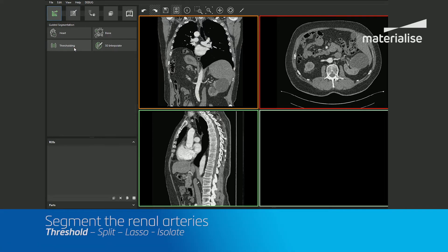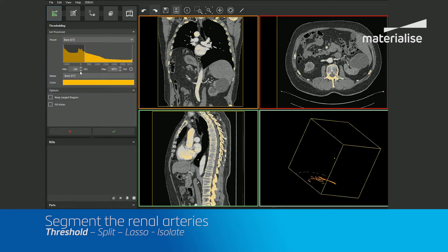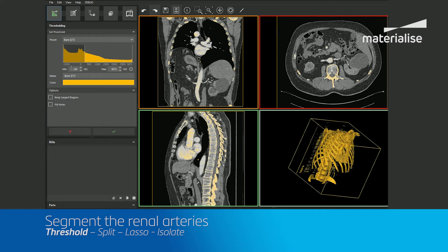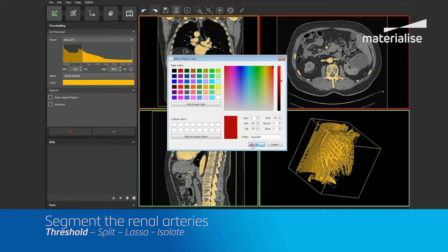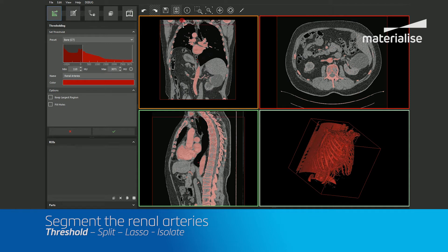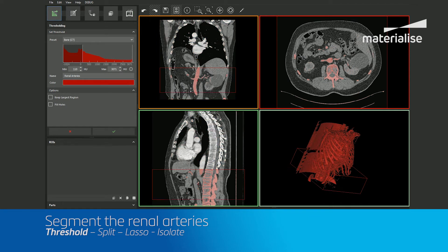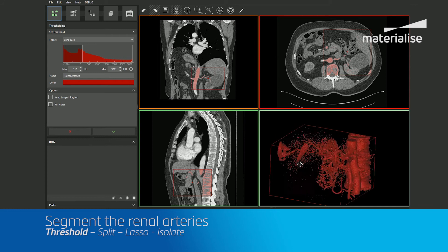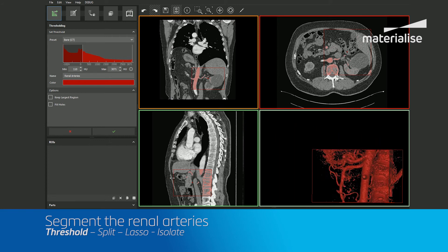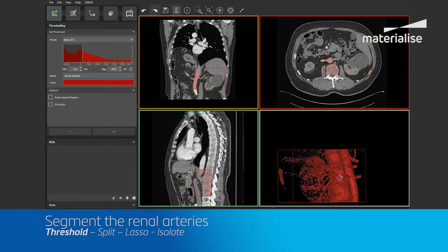First, we'll use the thresholding tool to choose an appropriate range of Hounsfield units to capture the renal arteries. You can rename your region of interest and select a preferred color to correspond with the anatomy. I'd also recommend adjusting the crop box to help isolate the renal arteries from the rest of the data set. Simply drag the colored box in your planar views, and the 3D preview will update in real time with your changes. You can check the boxes for 'keep largest region' and 'fill holes' to further optimize your initial segmentation.